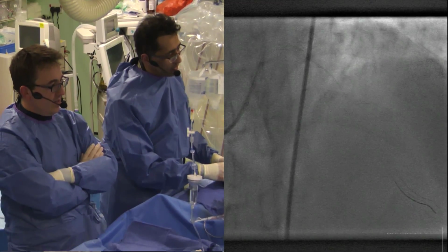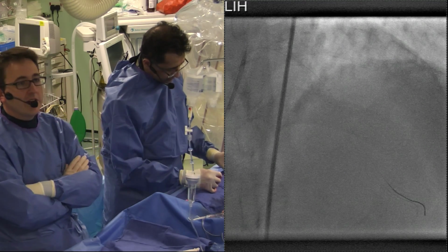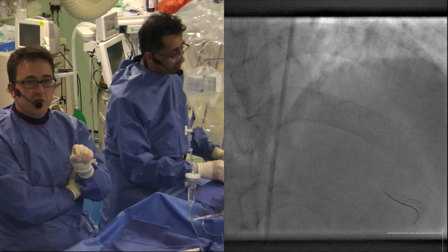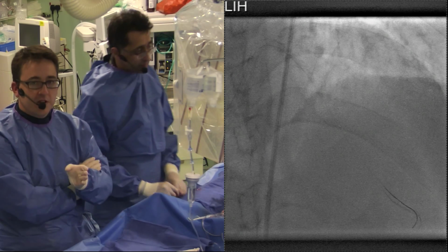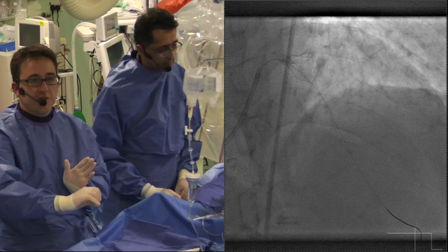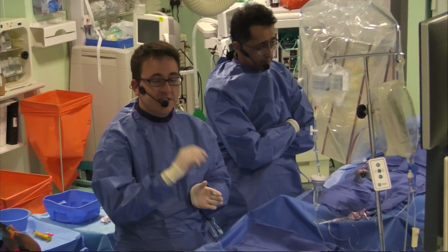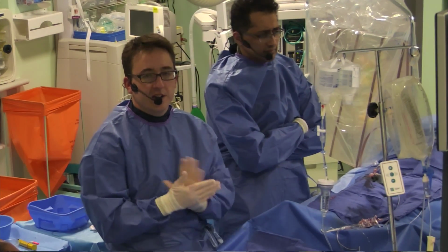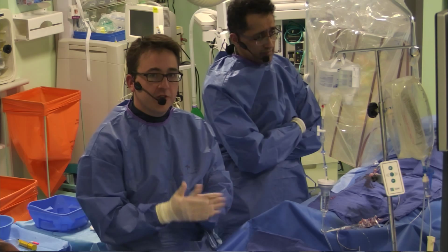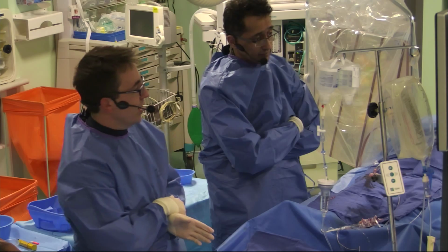Okay, that's fine. So I think we're well distal to any problem area. Again, I'm going to take the needle introducer back. Okay, so a question we've been asked here is how far should you make the measurement of the physiology beyond the stenosis? Well, if you've got a discrete stenosis, and you park this wire into a nice smoother segment of vessel, then you're fine. But ideally you want to be 2 to 3 diameter widths distal to the stenosis, to ensure that the flow patterns have normalised once again. So 2 to 3 diameter widths of the vessel beyond the stenosis you're measuring. But here we're clearly well outside that.